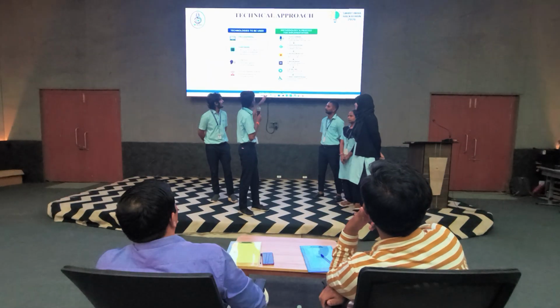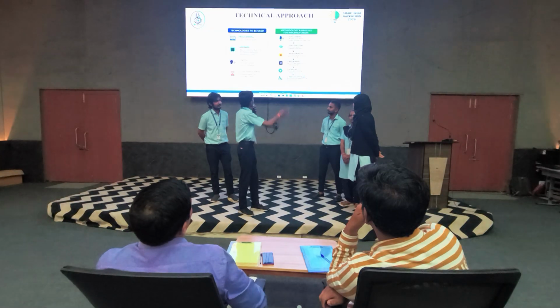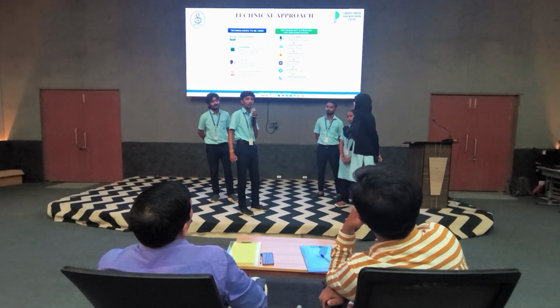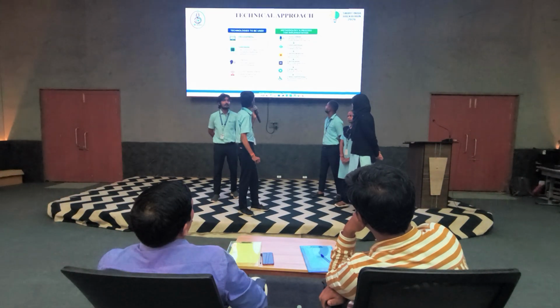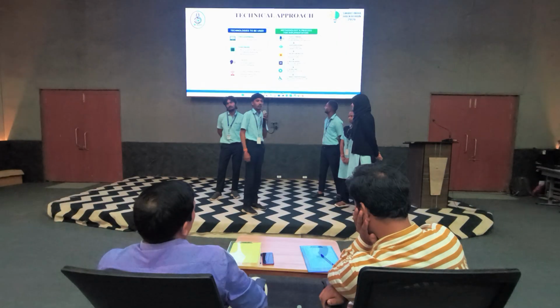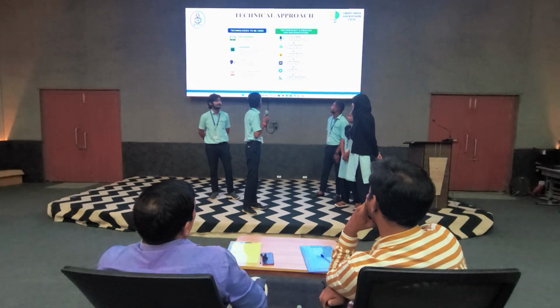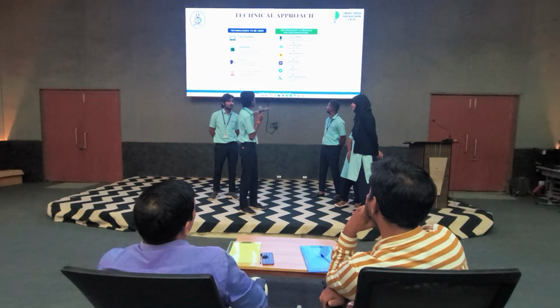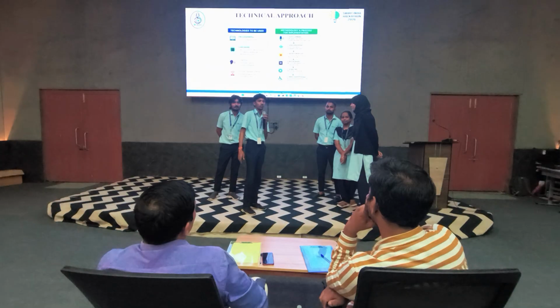The next topic is our methodology and process, meaning step by step processing in our smart electric wheelchair. First is the voice command, where the user uses the commands forward, backward, left, right, and stop. Then the voice is captured and processed by the system, where the microcontroller processes the command and sends it to control the wheelchair motors. Afterward, the DC motor driver controls the DC motor. Step 6 is the wheelchair movement, where all the user given commands are implemented in this project.